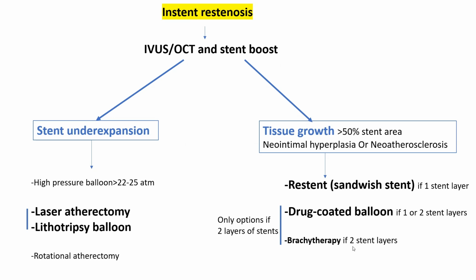Second note is regarding drug-coated balloons. Those are balloons that are coated with an anti-proliferative drug, typically paclitaxel, and they are also coated with a lipophilic matrix or excipient that delivers the drug. When they are inflated, they allow quick transfer of this drug into the vessel wall during a single balloon inflation.